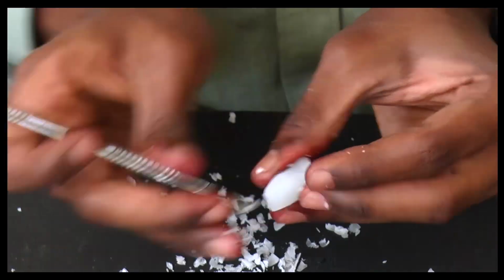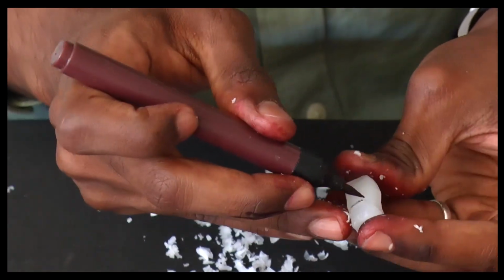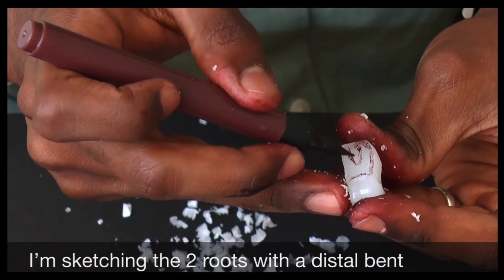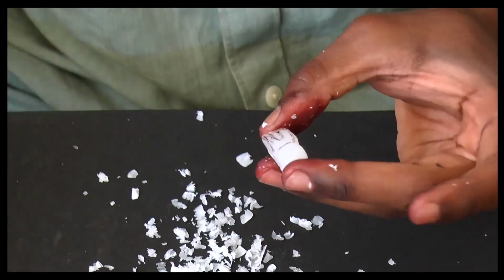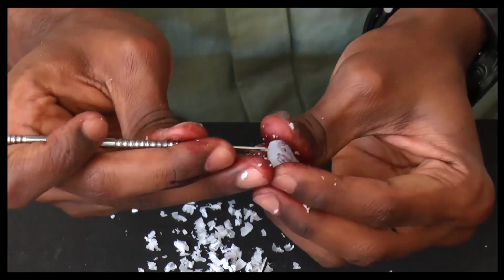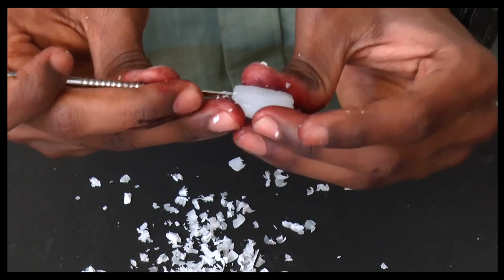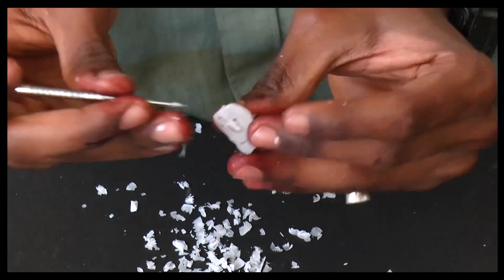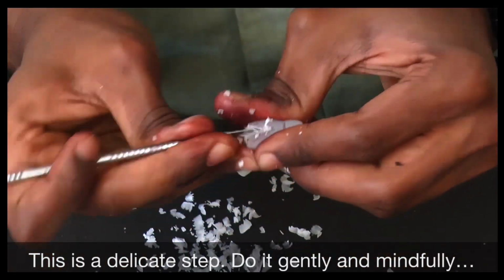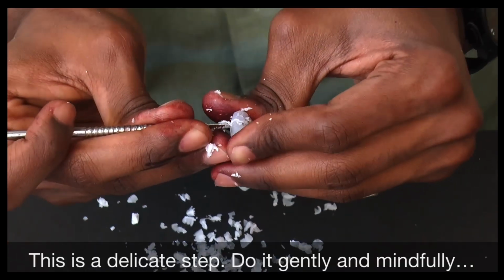Okay, so I'll now give this tooth the shape for its two roots. It has a distal bend, so let me draw it like this, distally. For this shape to be built, let me draw a line here and continue it here and continue it here as well. Okay, I'll just deepen this line now, deepen it further, a bit more.